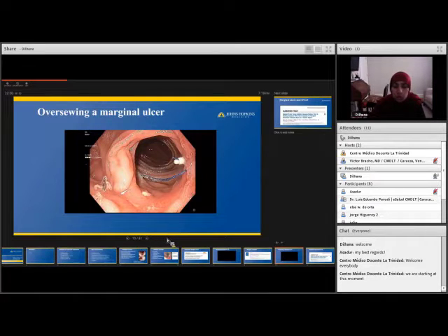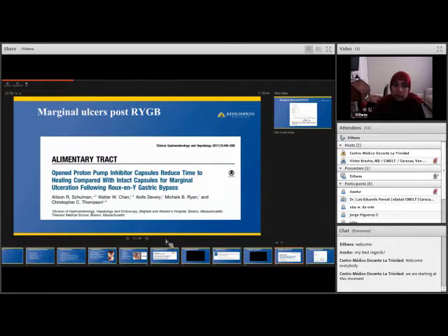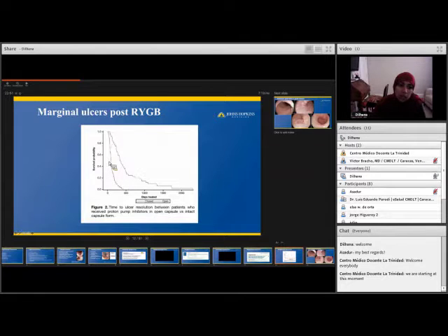So you can see here several full thickness sutures have been taken, and now we're deploying the cinch. And you can see the T-tag over there as well, and you can see the ulcer is gone now. This is the follow-up EGD, and you can see that the previous ulcer that was right here in this location has now disappeared. So successful use of endoscopic suturing, both for bleeding ulcers as well as non-healing ulcers.